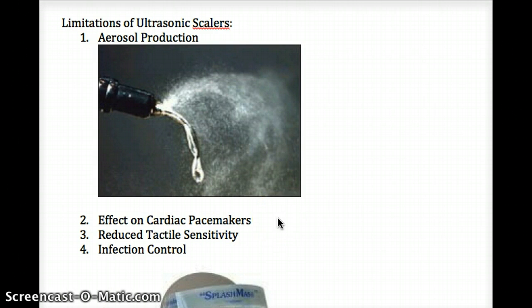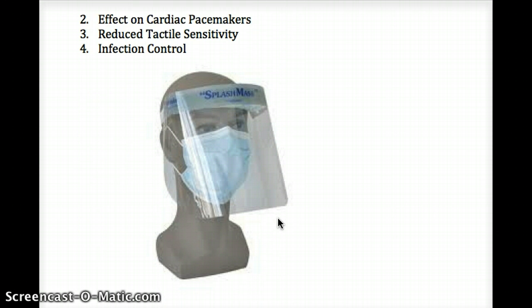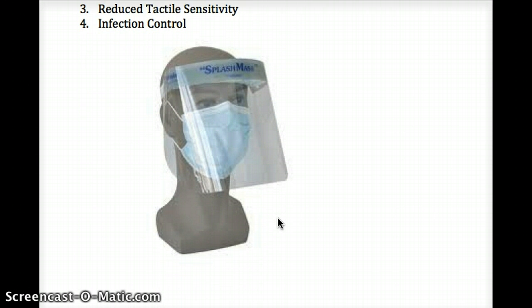And the last big limitation with these instruments is infection control. So you just want to make sure you're protecting yourself as well as protecting others. One great way to really promote infection control when using the ultrasonic instrumentation is to use a face shield, as noted in this image here on the screen.